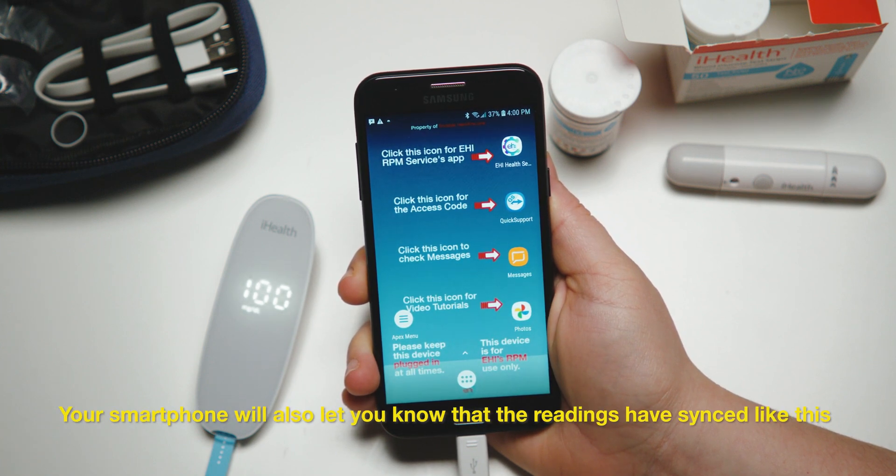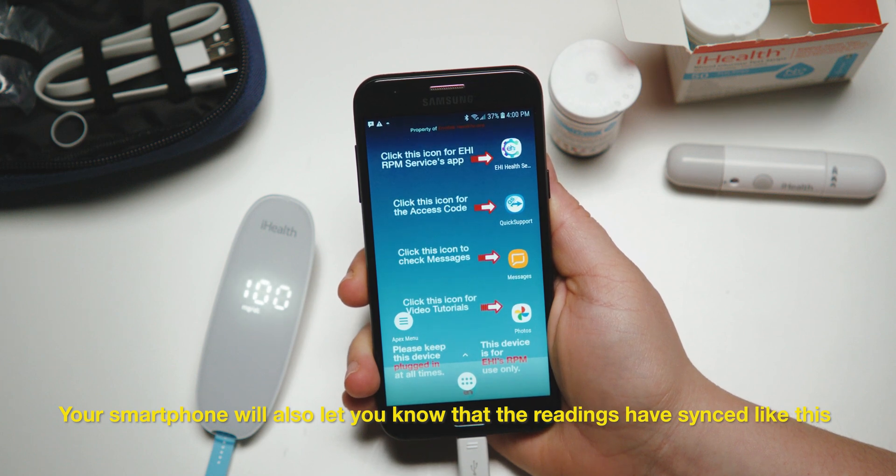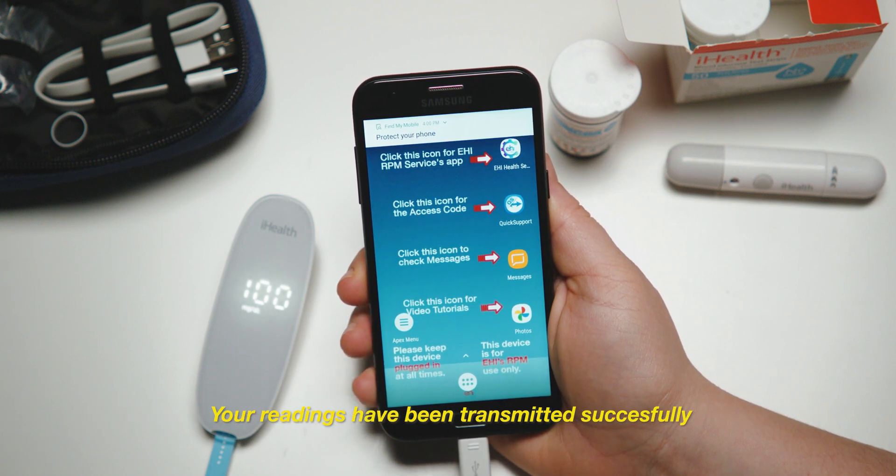Your smartphone will also let you know that the readings have synced. Your readings have been transmitted successfully.